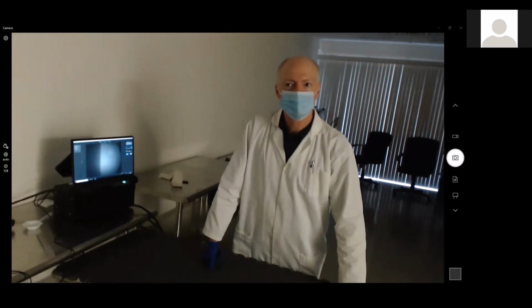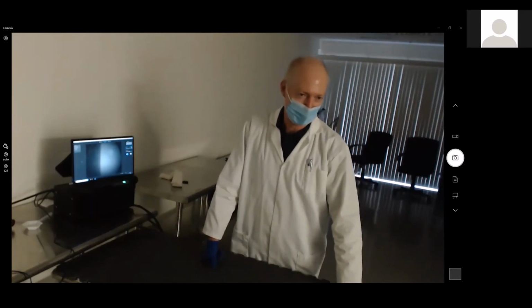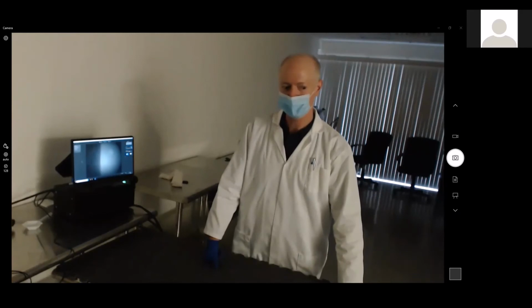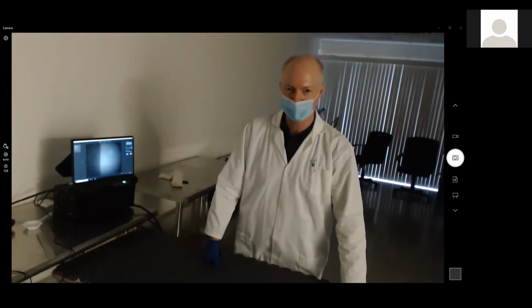I think it's just by pixels. I think you're right. I'm not sure exactly what feature in the software you're looking at, but I think measurement is going to be pixel values. And then, of course, based upon number of pixels on screen, we can even calculate out how that translates into some conversion of microns or metric.